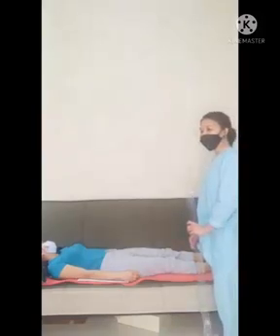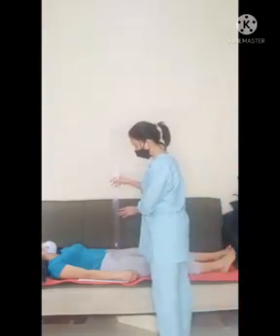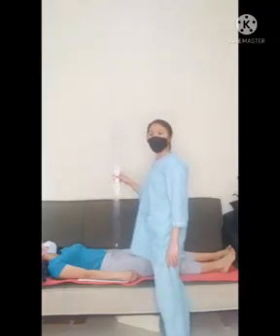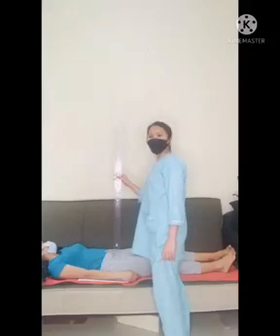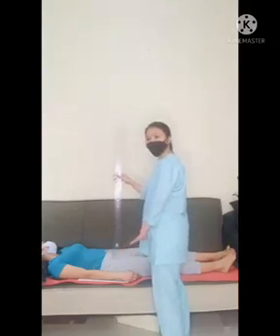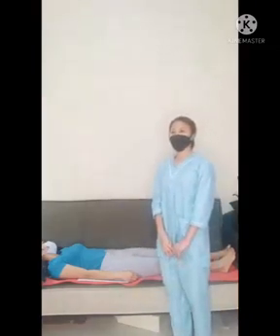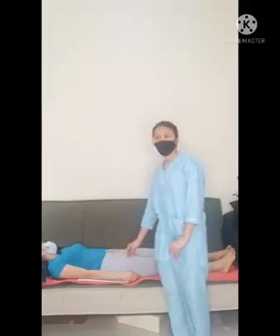So, our central ray in this projection is on the femoral neck, entering approximately 2.5 inches distal on a perpendicular line down to the midpoint of a line between the ASIS and pelvis pubic symphysis. So, the structures shown in this projection are the hip and the greater trochanter.